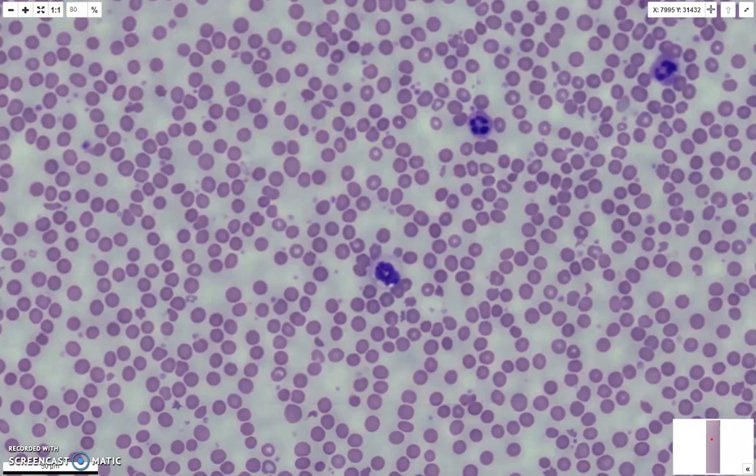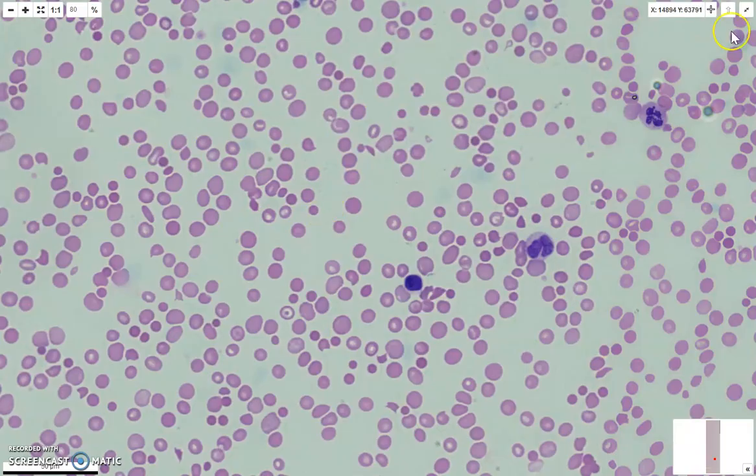So the one that we really would like you to remember is this guy, where there are no platelets and lots of schistocytes with polychromasia. So they're two examples of MAHA, this one being the more obvious one for you guys to learn. As I said, that has been induced by the E. coli toxin, and the poor girl has HUS. Right, so on to the next two slides.